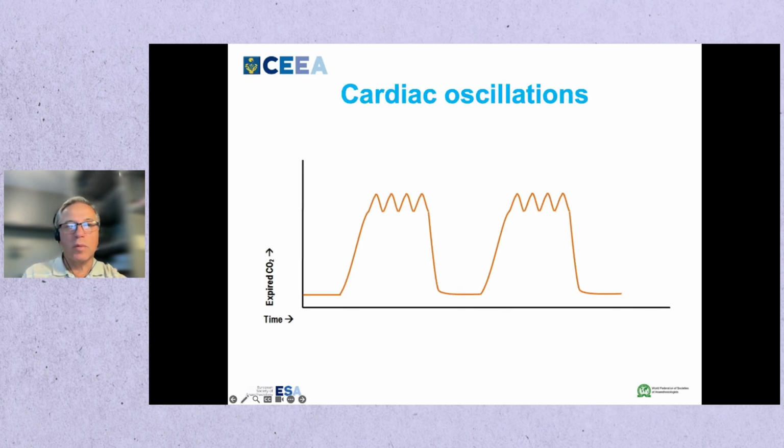This waveform represents the pulsation of the extra-large heart transmitted to the lung parenchyma. The resulting changes in the lung volume are enough to move a small amount of gas back and forth, creating ventilation of some sort. In some circumstances, this may be a feature of cardiomegaly.